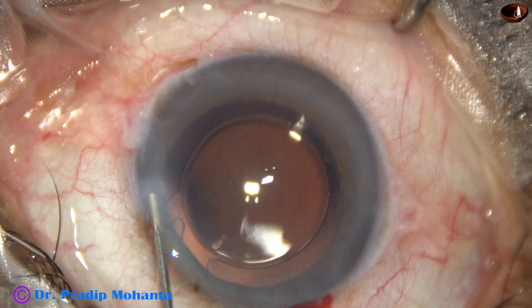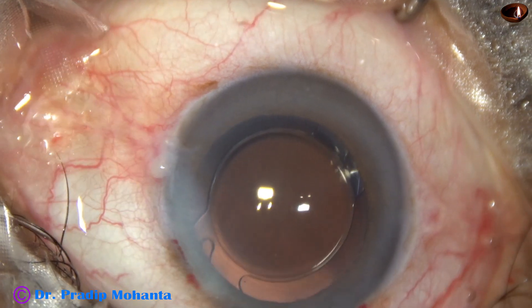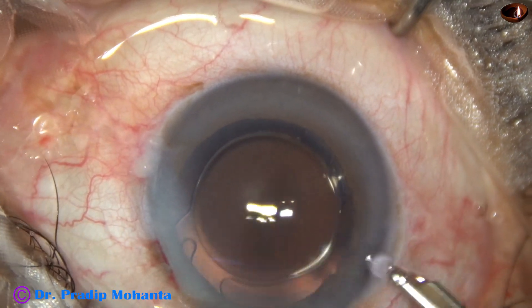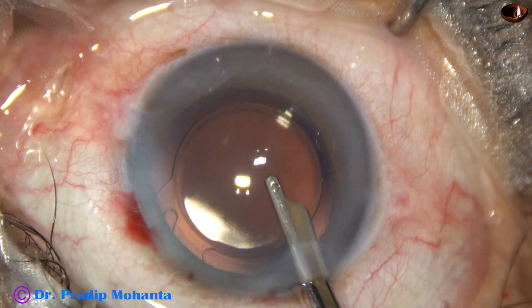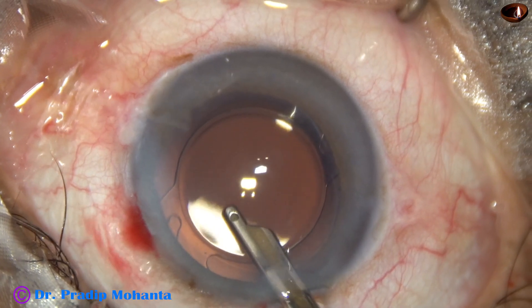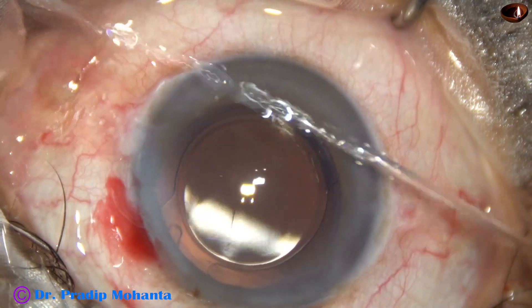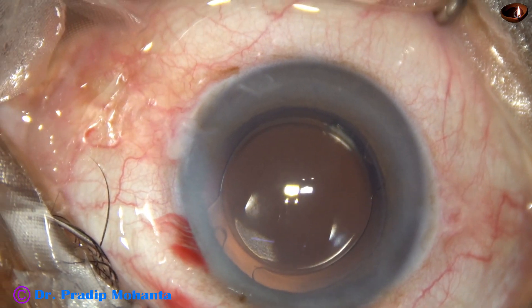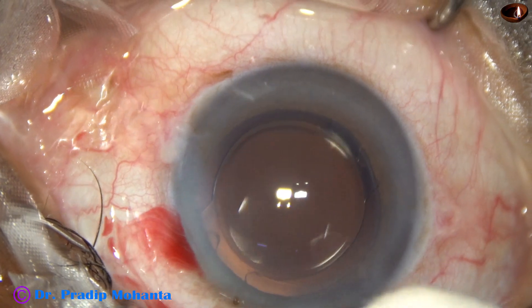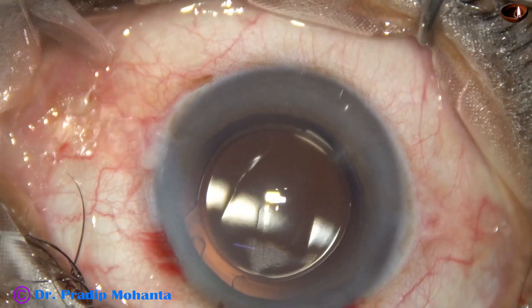The side port is closed by hydrating the corneal stroma. A final lavage of the anterior chamber is done. A gentle stream of BSS is directed towards the corneal endothelium, removing any viscoelastic sticking to it. The anterior chamber is nicely formed. A cotton-tipped applicator is taken and the integrity of the wound is checked. A few drops of moxifloxacin are applied over the cornea and the case is concluded.